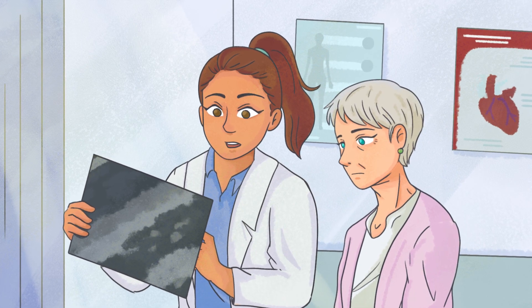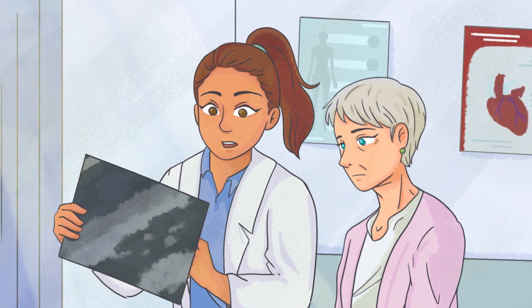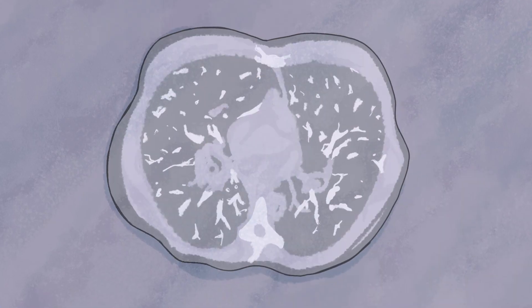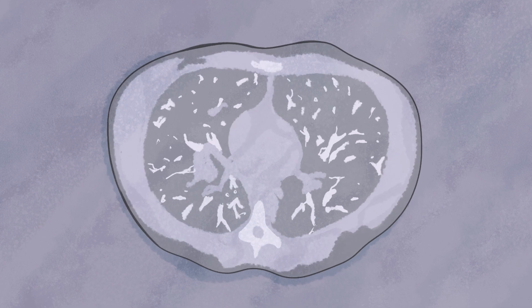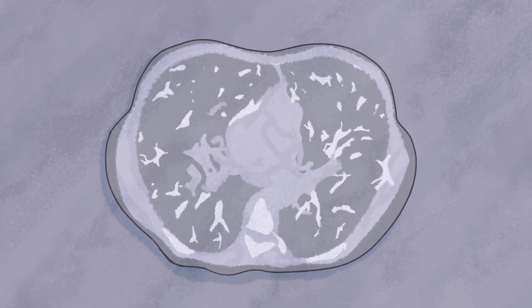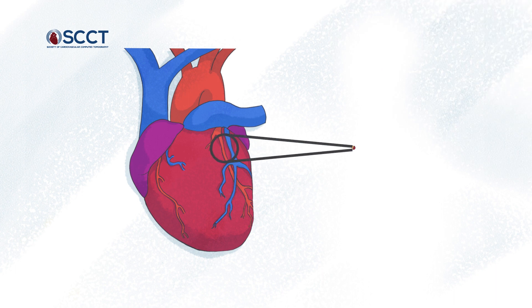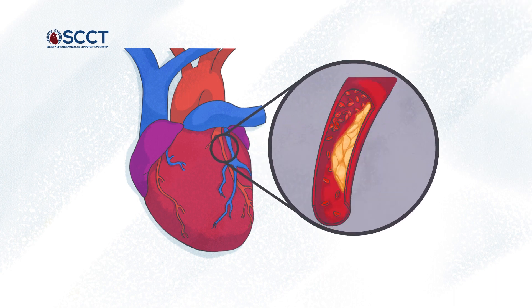This is a 53-year-old female patient who came in for a non-contrast chest CT. Here are some white dots in the LAD and in the diagonal branch — this is coronary artery calcification. You've taken somebody with an unknown risk for coronary artery disease, and because they have coronary artery calcification and they're under the age of 60, they've moved to a higher risk threshold. This information could alter their management, including the need for preventative medication.